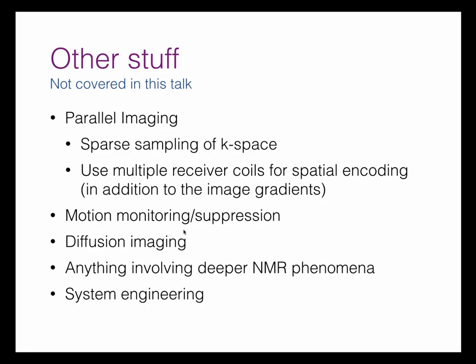Okay. So, if you were doing, like, in a 7T, you can test the cerebellum with BOLD imaging. Is there a reason why we always go axial? For instance, if you want to have short TRs and you want to focus entirely on the cerebellum, let's say you were interested in the cerebellum and the motor cortex, right? You could get it with your angle, a sort of oblique acquisition.